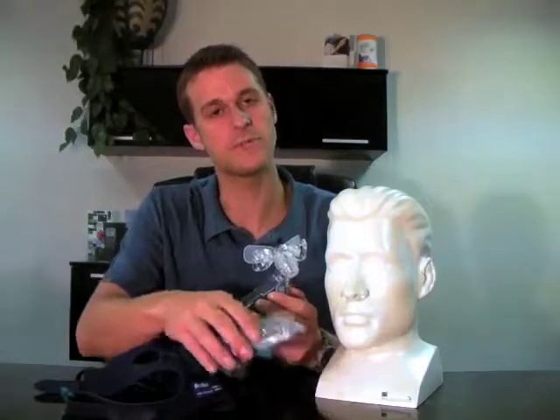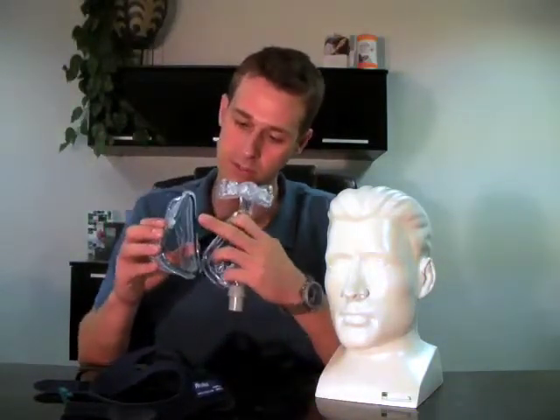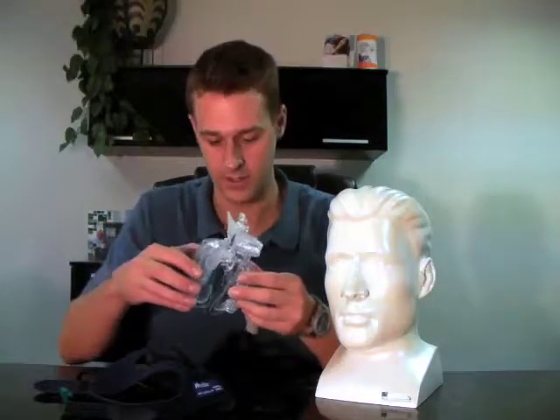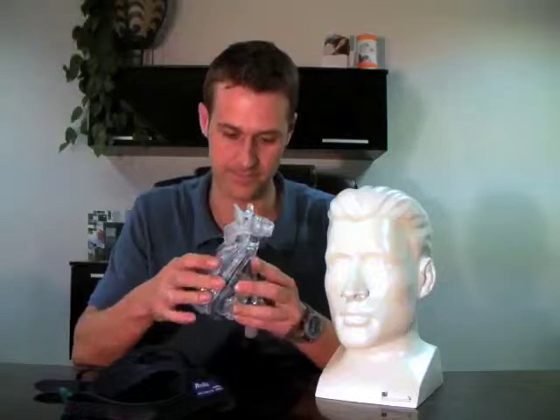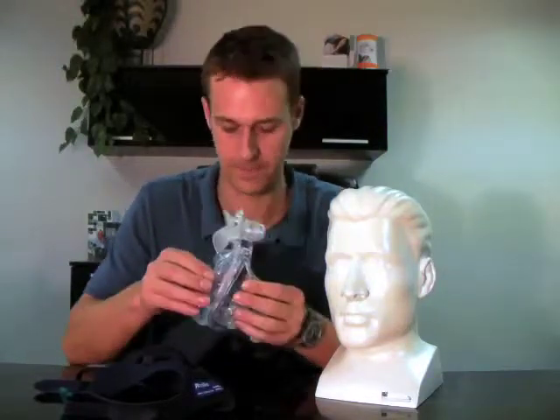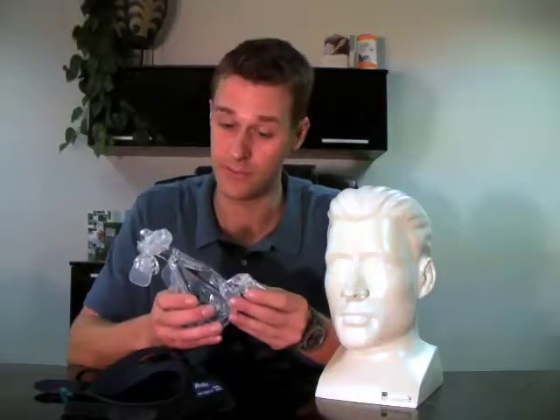To reassemble the mask, the first thing that we're going to do is take the cushion and take these three points and fit them into the slots that are already on the mask frame. Sometimes it will click — as if you could hear it there.